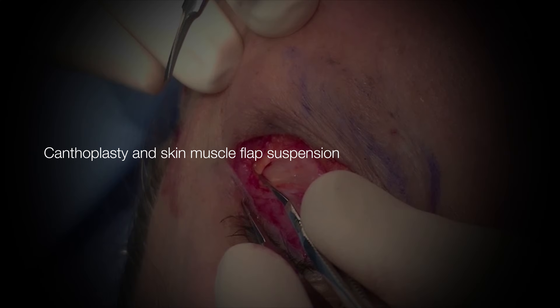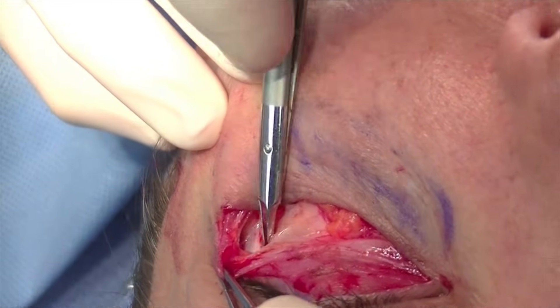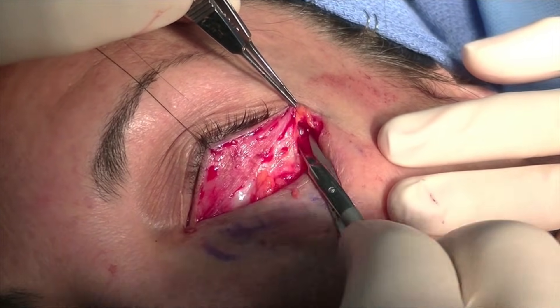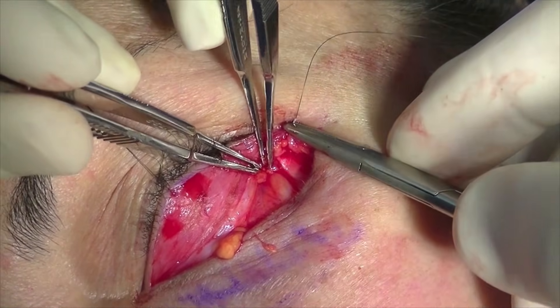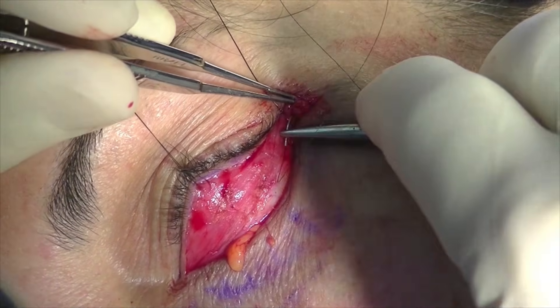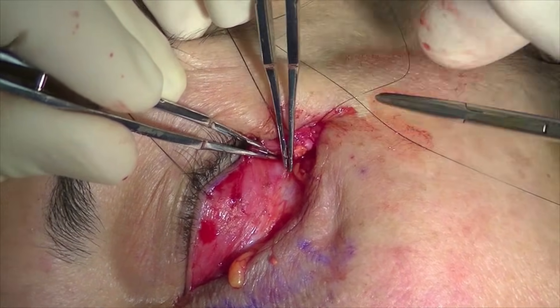A canthoplasty and skin-muscle flap suspension is now performed, first by dissecting in the area of the lateral orbital rim superiorly. As you can see, this dissection is on the inner aspect of the orbital rim. Sutures are placed up high, just above the area of the lateral canthus — two sutures are placed, one for the canthoplasty and the other for the flap suspension.